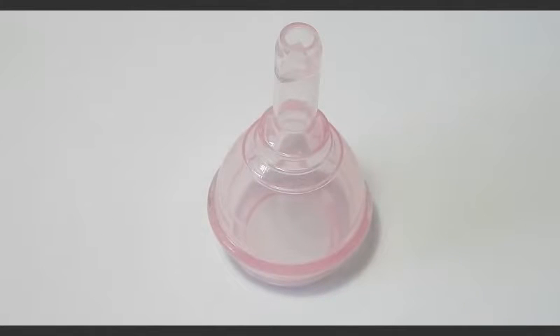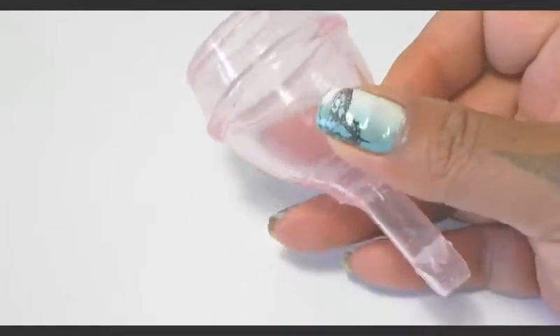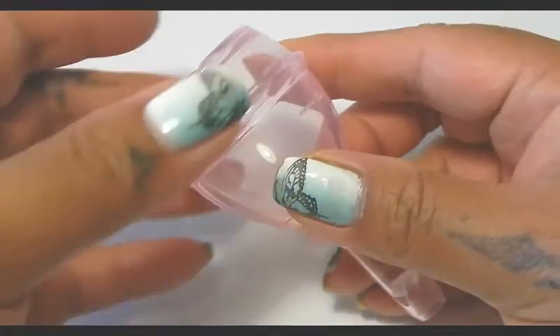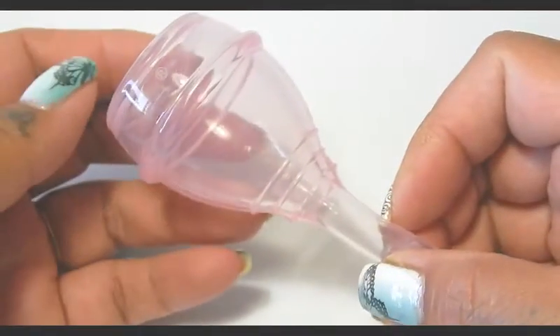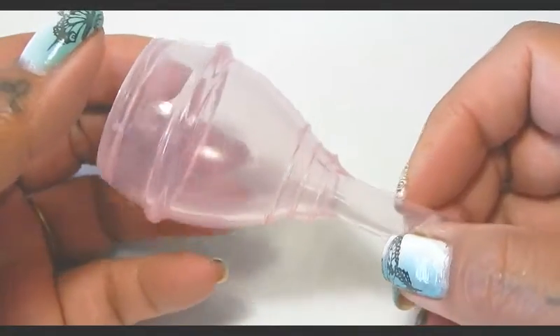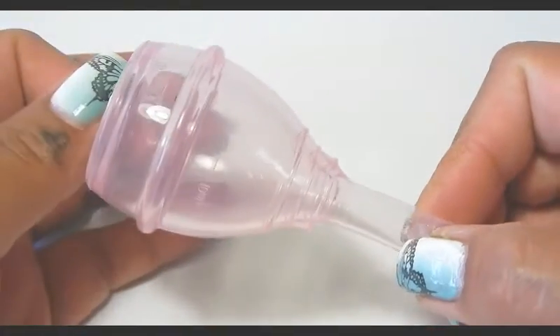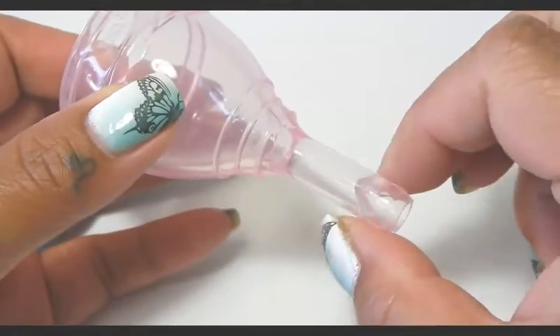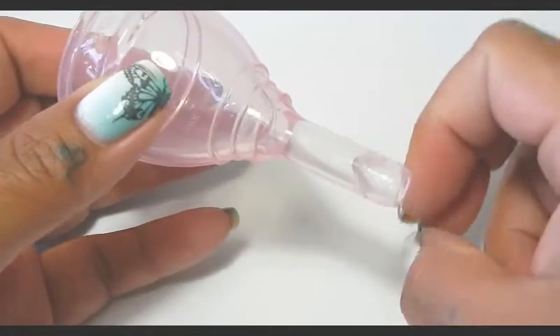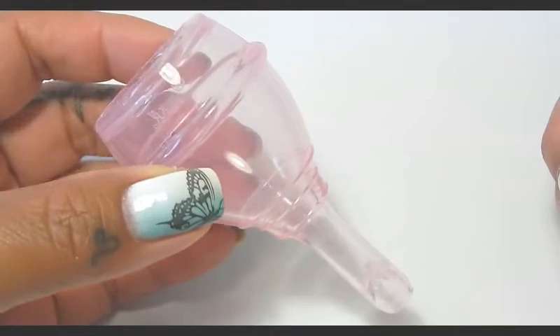Hello everyone, it's Red Herring, and in this video I'm going to be giving you some detailed information about the iWell cup. I did put out a couple of videos but they were more of my personal experience with the cup, so I did want to go over information and details about this cup, as well as some instruction and demonstration on how the teat on this funnel style menstrual cup works.